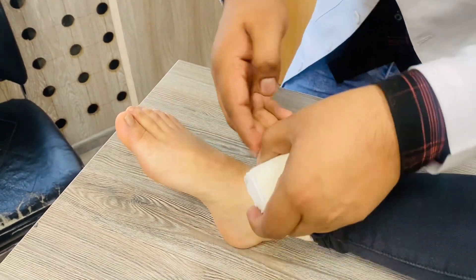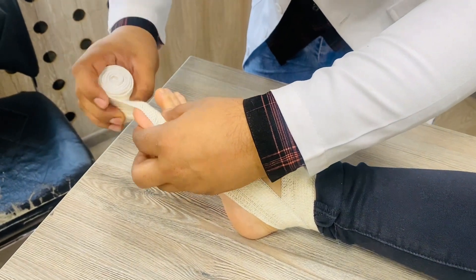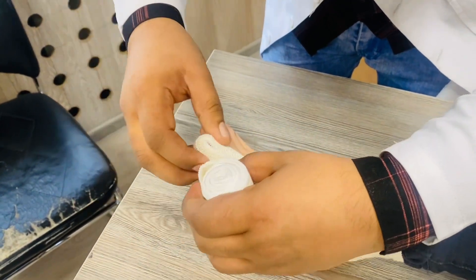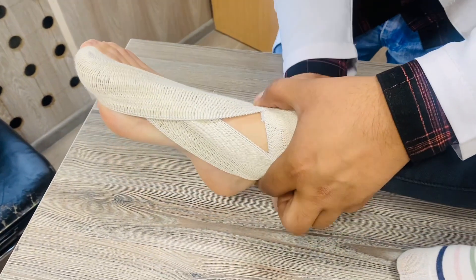After completing the two circulations, just move towards the injured finger like this, cover the finger like this, and again come towards the leg like this.